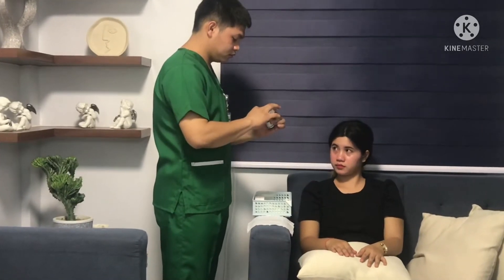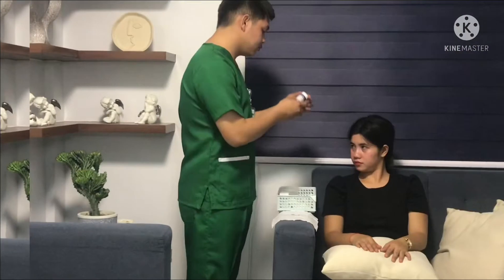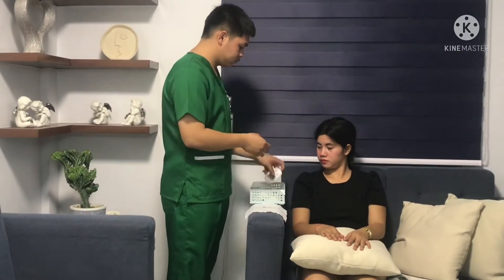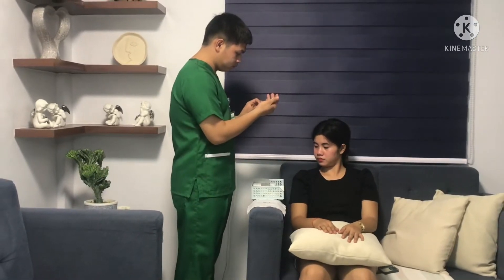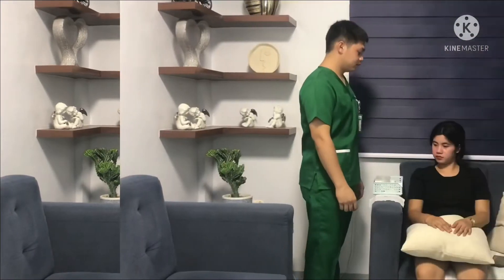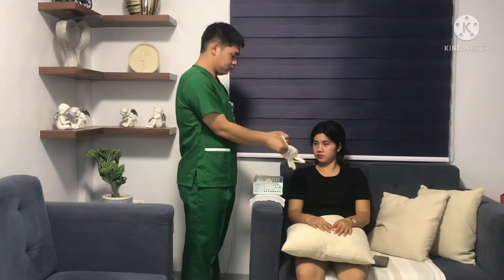Do not touch the test pad portion of the reagent strip. Follow the manufacturer's instructions to prepare the meter for measurement. Place the unused reagent strip in the glucometer or on a clean, dry surface. Apply non-sterile gloves.